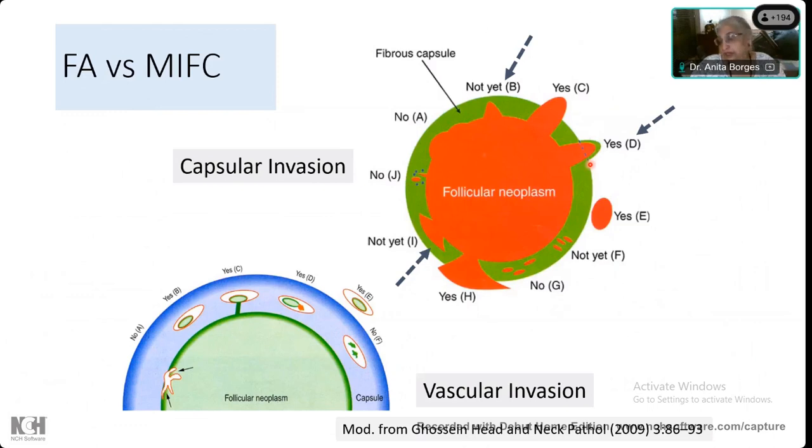Okay, so I saw that Anshu had written over here that many of these can be sinus tract when somebody has done an FNAC. Yes, it's possible. You have to look to see whether there is blood in that tract or whatever. But according to Gossain, that's why only according to Gossain it makes sense, that you can have multiple capsules that occur after the first capsule has been breached. And this is what he's saying. And that's why he's drawn a dotted line that this was the original capsule.